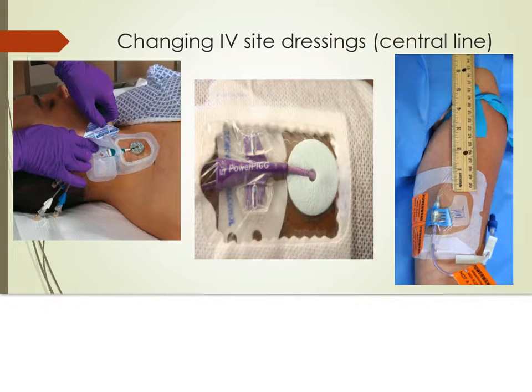If the dressing changes for a PICC line, apply skin prep, allow to dry, then apply the new securement device. Apply a new biopatch if required by your facility policy. Apply sterile dressing with sterile technique. If the dressing changes for a PICC, you will need to measure with a measuring tape from the insertion site to the hub to make sure that the catheter location has not changed.